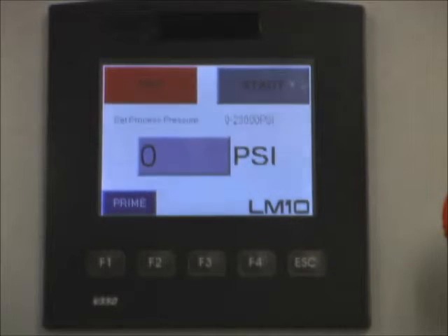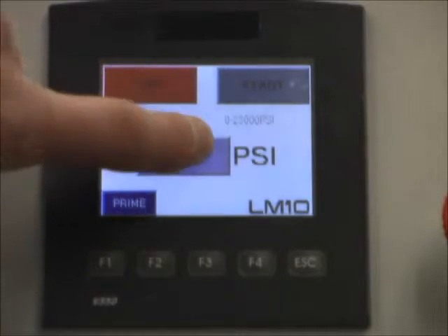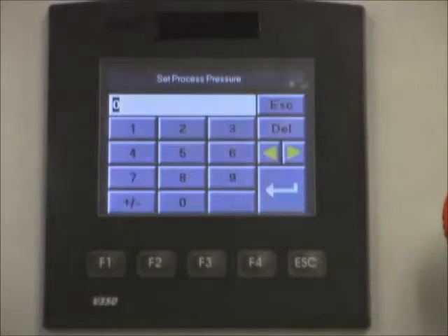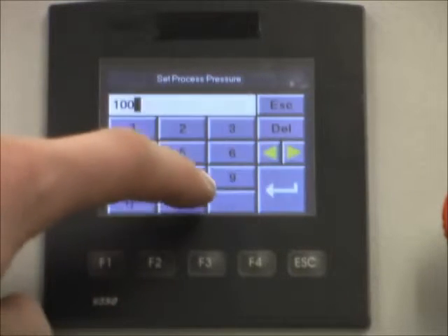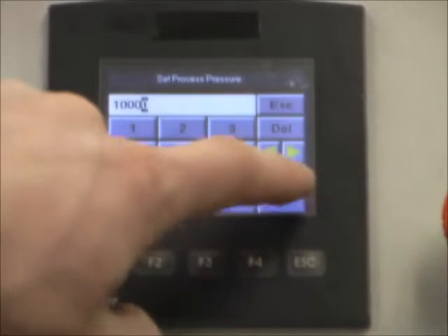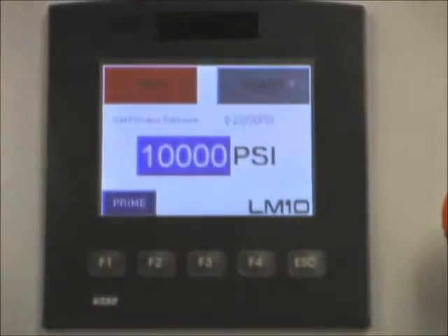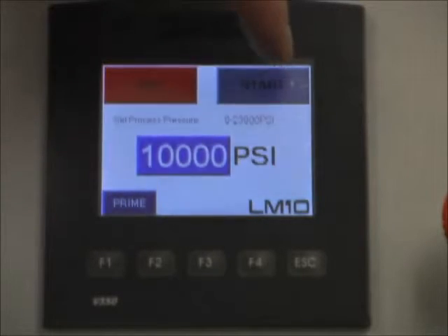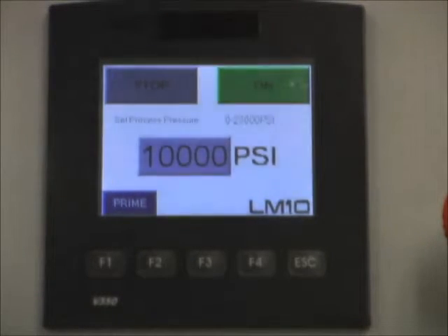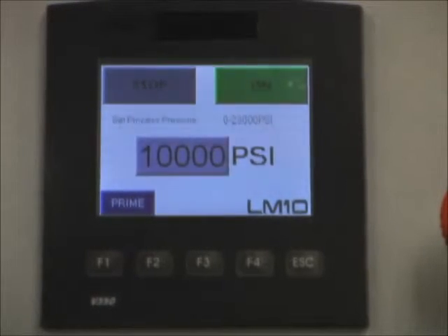The next step is to set the desired process pressure. To do that, we will push the middle button, and here we can type in whichever pressure we would like to run at. For this example, we will run at 10,000 PSI. We will hit the return button on the bottom right. To start it, we hit the start button and the machine operates.